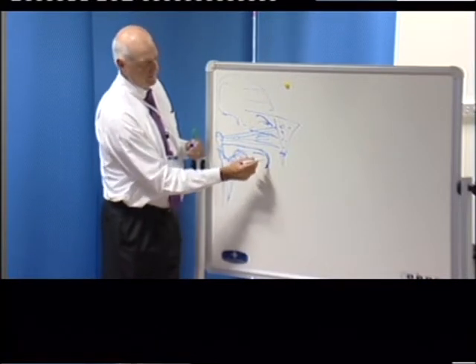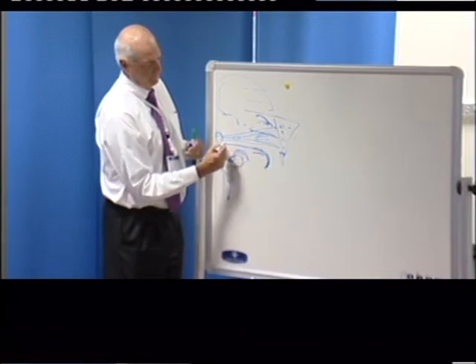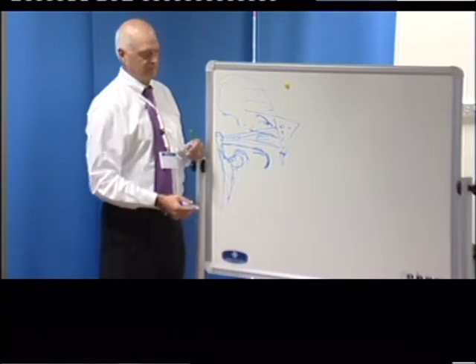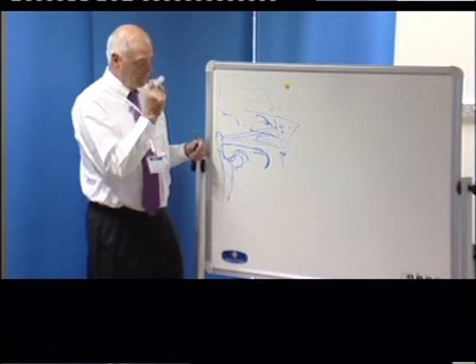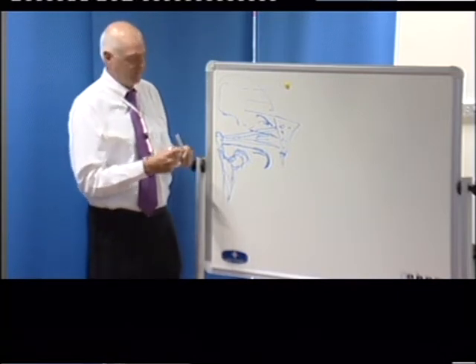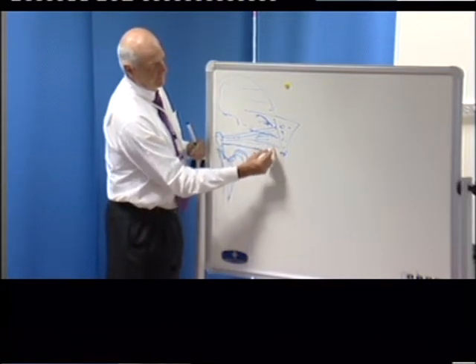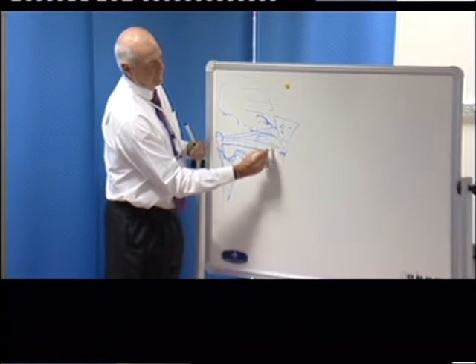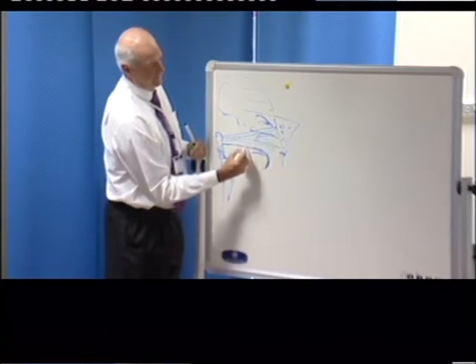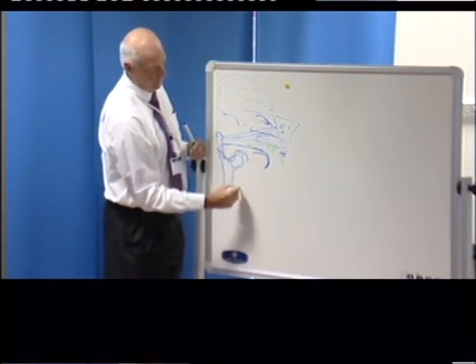Then I can call this my waterfall, because you see it plunges into the pelvis. So when that happens, then we can see the sacral plexus, and then it becomes the piriformis, the sciatic nerve, and then it goes down.